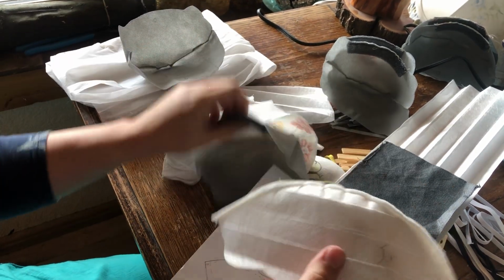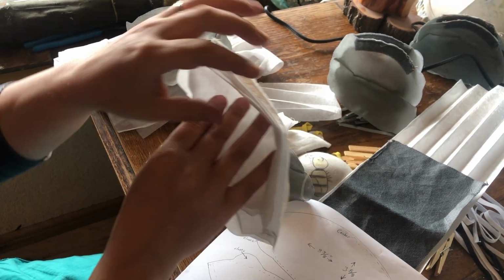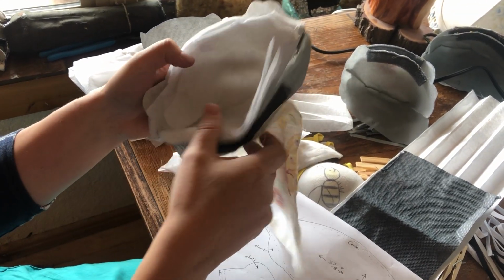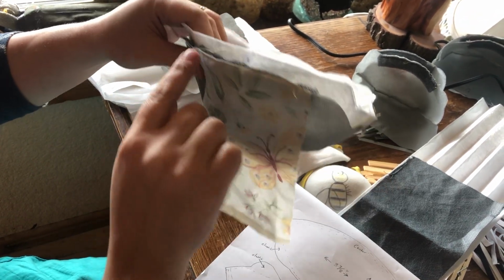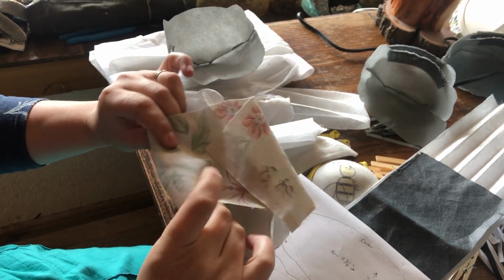And then you tuck it inside of this piece. You've got a chin and a nose. Here's a nose, here's a chin. Put it together like that. And then you are going to get it kind of lined up the best you can, and you're going to sew all the way around. Then you're going to flip the nose piece in.